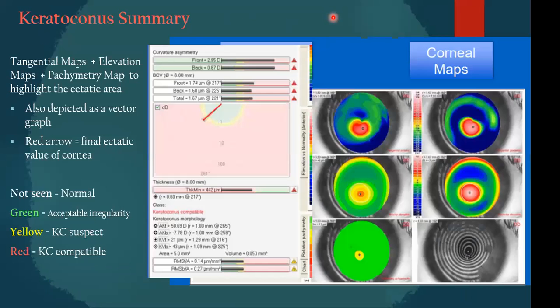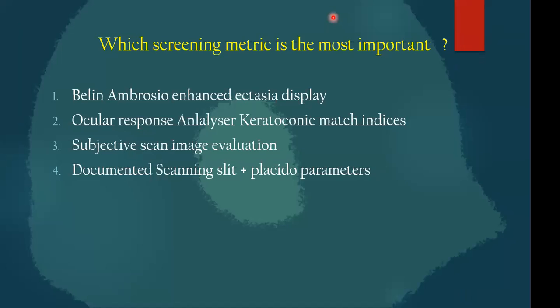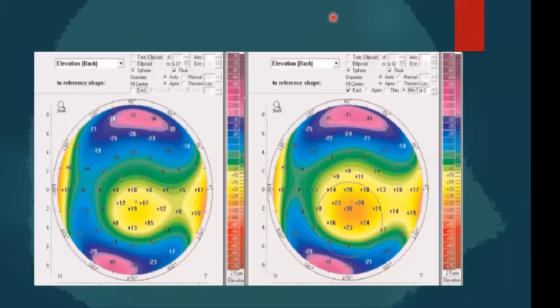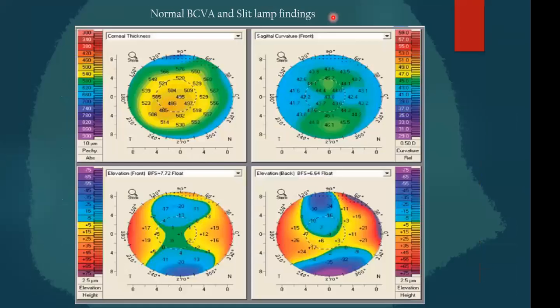Okay, I don't think I have it, but what I can tell you is that in a post myopic refractive surgery, the central cornea is going to be flattened. So on this quad map analysis that I showed you here, this part over here is going to be blue. It's going to be the cooler colors in the center if we do a myopic LASIK.